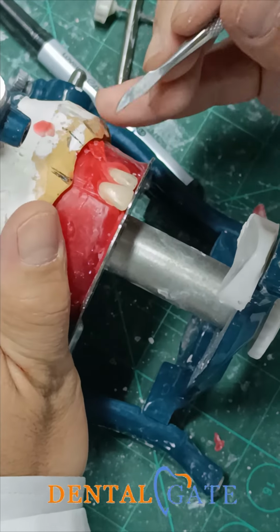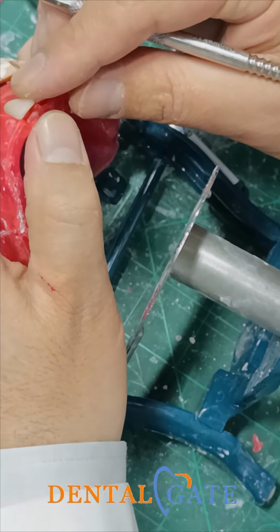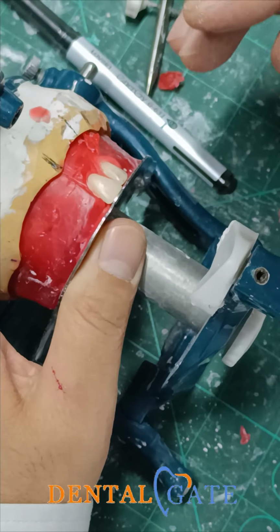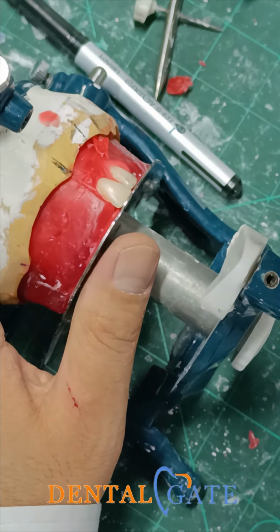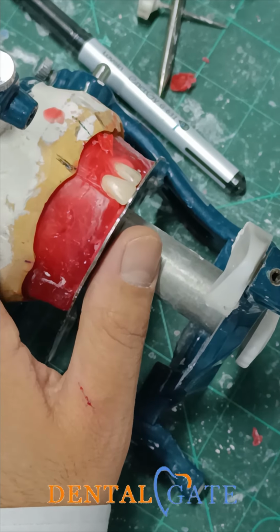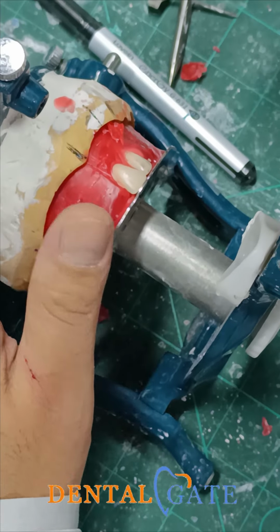Now, you can see this portion should be prominent, so the lateral should be pushed lingually. It will affect the overjet and the overbite. I can make adjustment with the lower. This is not the final decision, but I will start with this criteria.